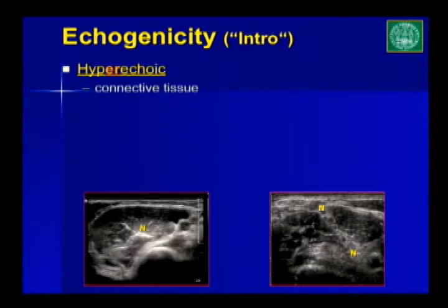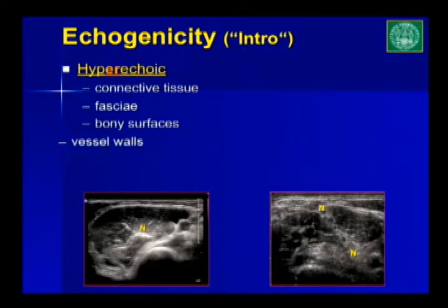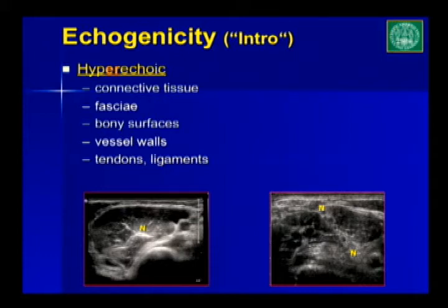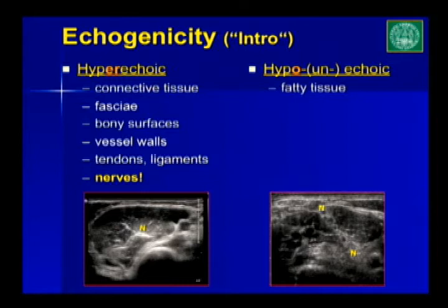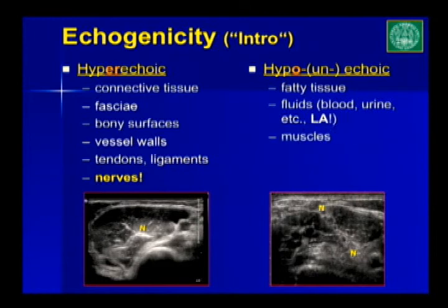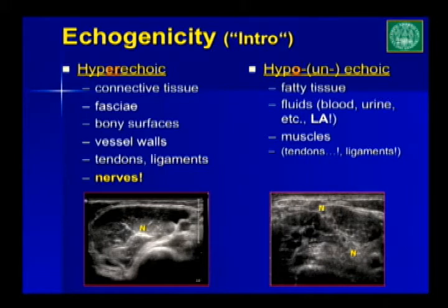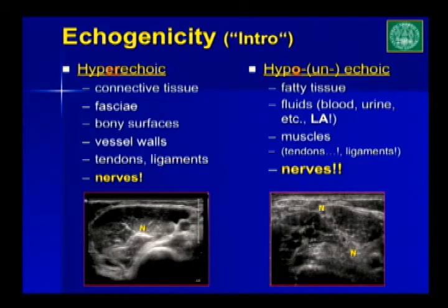We are talking about hyperechoic and hypoechoic structures. Hyperechoic structures include connective tissue, fasciae, bony surfaces — very beautifully seen here — vessel walls seen in the axillary artery, tendons and ligaments, and nerves. Hypoechoic structures include fatty tissue, which is very important. Not all fatty tissue is hypoechoic — for example, in MSK ultrasound there are fat pads that are hyperechoic. Fluids and local anesthetic you apply are also hypoechoic. Muscles, tendons, and ligaments are in brackets because not all of them are truly hypo or hyperechoic, depending on your scanning expertise. Two different nerves are shown — one is oval, the other is round — dark nerves between two muscles in the interscalene groove, and a very bright nerve within a muscle.